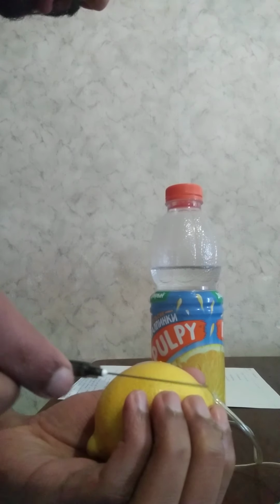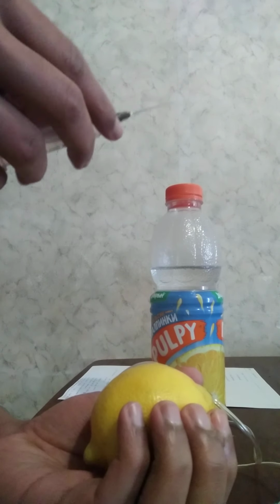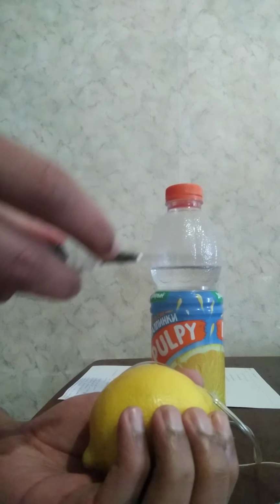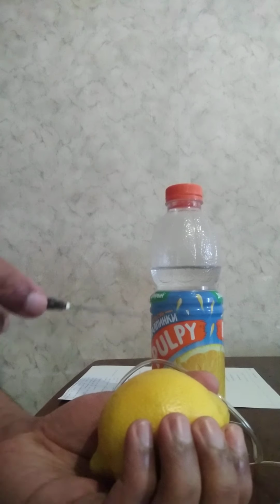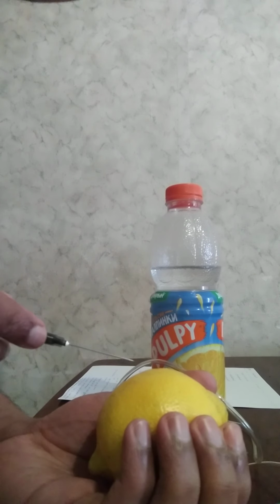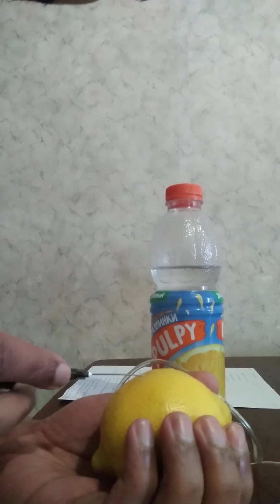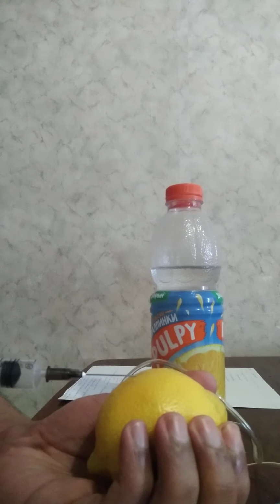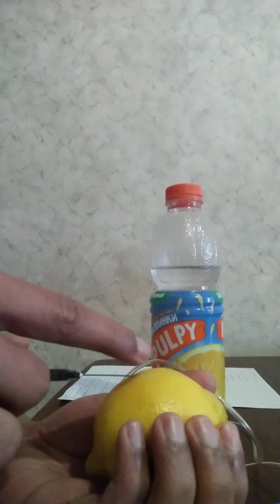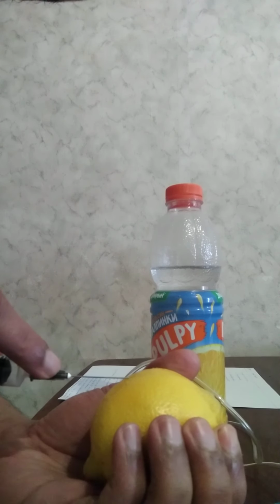The needle is chosen such that it's a 25 to 27 gauge needle, around 1 to 2 centimeter in length. It usually has a pink tip. Now, advancing the needle, you should keep the bevel upwards, and the needle is inserted at a 15-degree angle to the skin, like so. After advancing a few millimeters, we can advance the medication slowly, such that a wheal is created at the site of injection. Once the wheal is created, we can withdraw the needle.